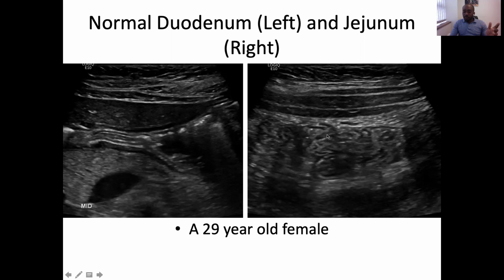So usually within the prepared bowel, we tend to have empty lumens, and that helps you to see better. I must mention that in preparation for an ideal bowel ultrasound, you're better off having a patient who's been fasting for at least 4 hours. That helps to empty out the bowel lumen and reduce bowel gas and bowel gas shadowing, and hopefully that helps with visibility more.